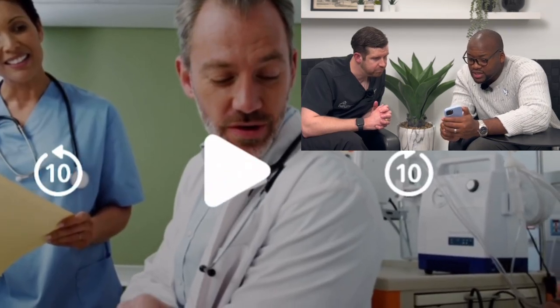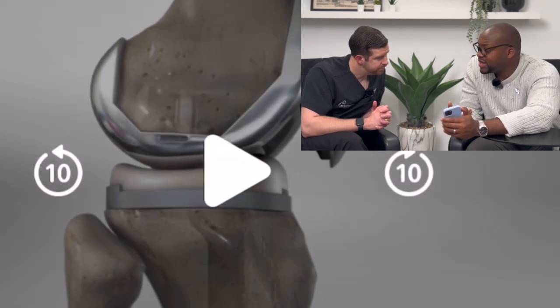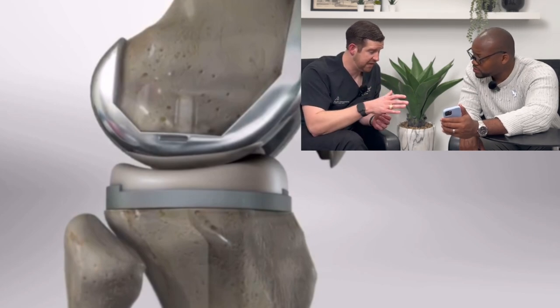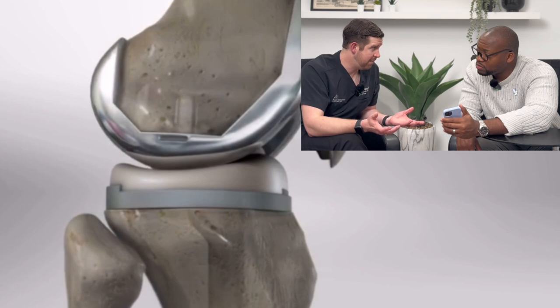So that cement — there are basically two main ways to get something to stick to bone. The most common way is to cement it in place, which I describe as glue — grout is probably more accurate. It bonds both to the implant, and since bone is very porous, if you pressurize it, it gets into the bone and unitizes everything together. Now we are switching over, especially in hips — in the United States most of the time we're not using cement at all — and we're starting to do that in the knee as well. The reason is that if the bone grows into the implant it might last the rest of your life, which is ideal, especially as our patients are getting younger.